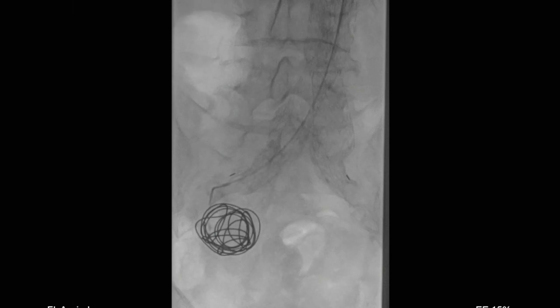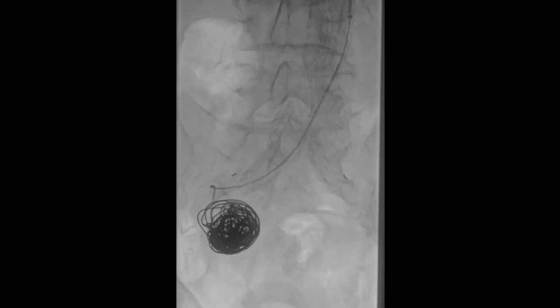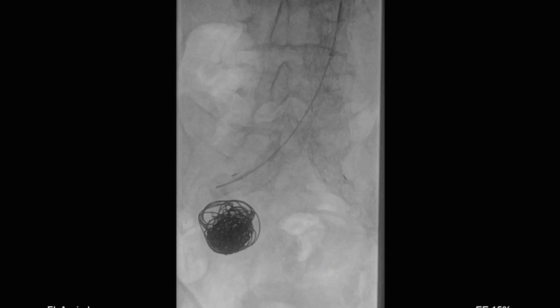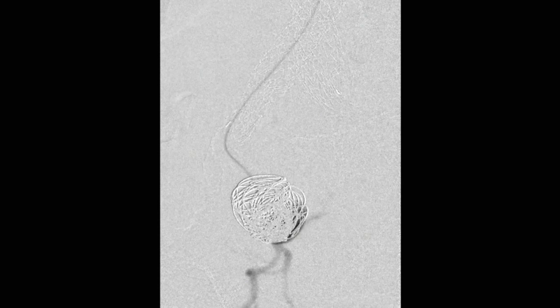You can see the coils packing this nicely. We started with 20mm by 40s, went down to 15mm by 20s, and then used 10mm by 20 coils to pack the inside. They always seem to use more coils than you think they're going to require. One of the challenges is that once you get these coils packed in there, it's difficult to know where the end of your catheter is — sometimes you can use a roadmap to help see this. We're injecting now with the catheter straight inside the aneurysm, and you can see the branches coming out the bottom.